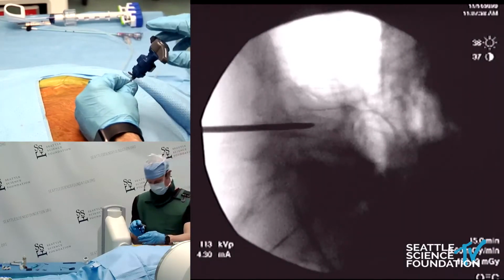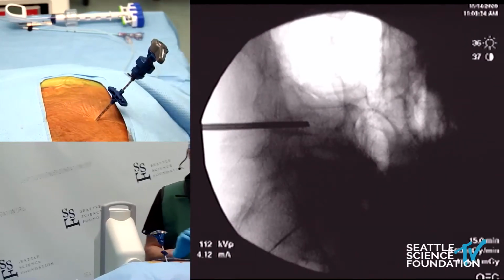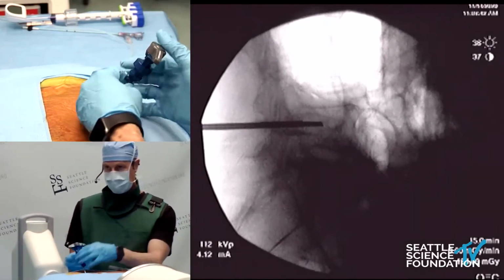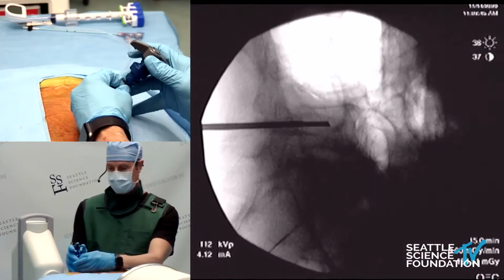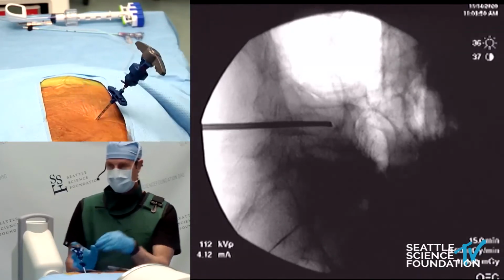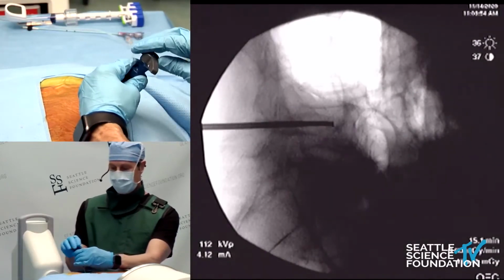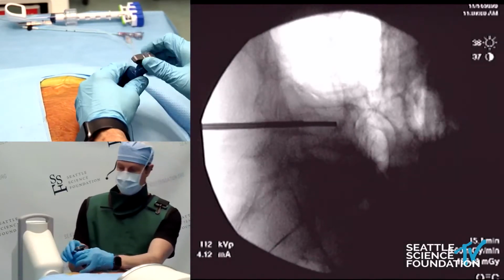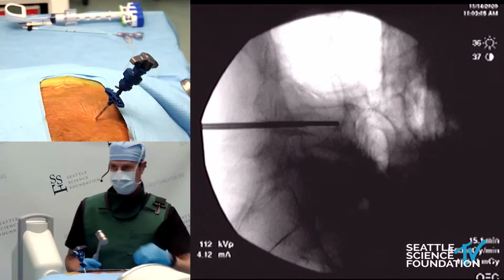So I'm going to put it directly across here, and we'll place it in the posterior portion of the vertebral body, like so. And I'm going to push it in, and as I do so, we'll get it about halfway across the vertebral body, and we will start to make the turn. And you'll see as we advance forward that this thing will start to foreshorten. And I'm going to hammer the whole thing in, as we're a little bit short.